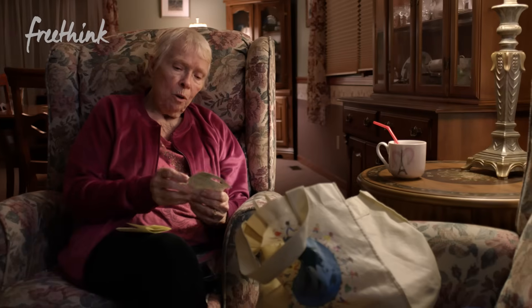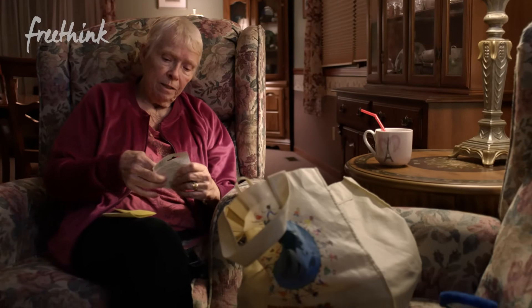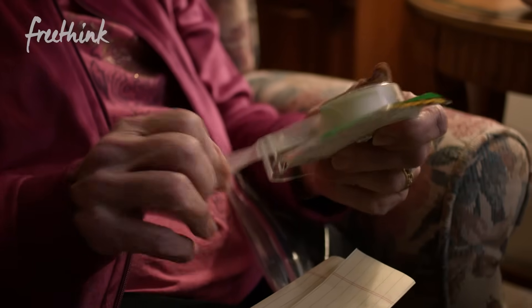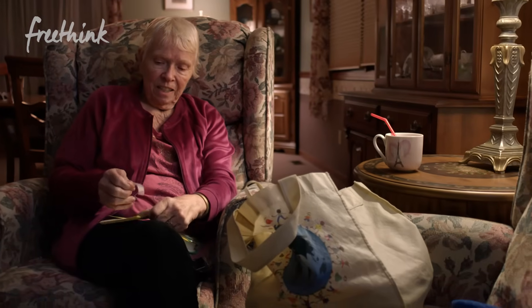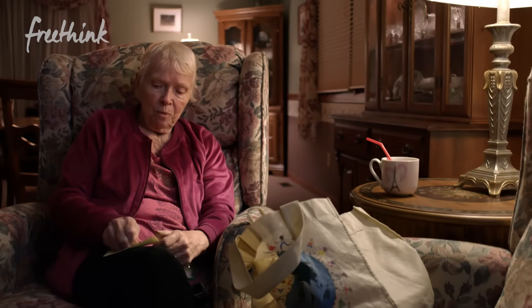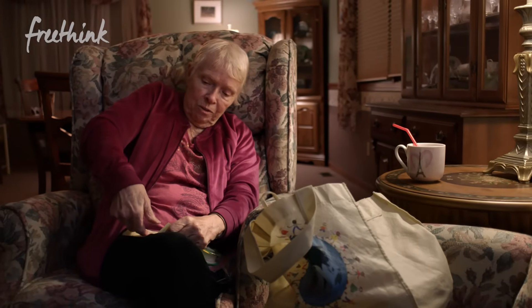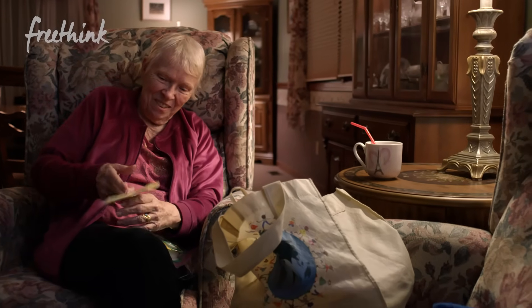Scotch tape is sometimes called magic tape because it sticks to everything and does whatever you want it to do. But for me, it plays tricks on me. I want to get this taped down. Now that came off pretty good — but whoops, it didn't come off.